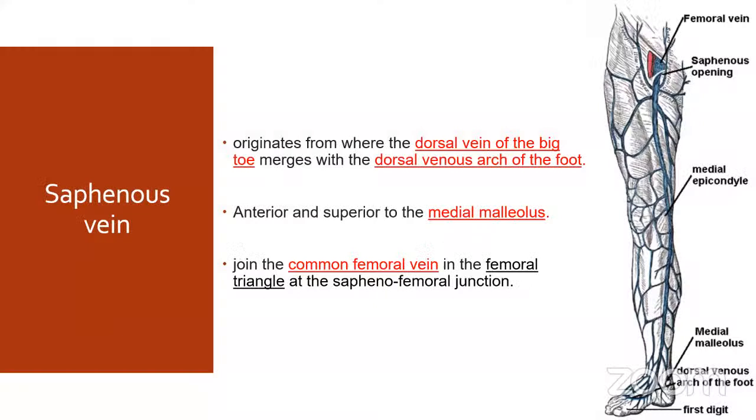It's individualized, depending on the patient. One patient is fat, another is thin. Some are so thin that you can see the veins through the skin before incision. And in other patients you go deep and couldn't find or differentiate between the veins, or sometimes the nerves running along the vein, so you wouldn't appreciate it. So it depends on the patient itself, and on your incision, which is to be 2 centimeters proximal to the medial malleolus, and go on. But I think this picture is a standard that we can go on, okay?